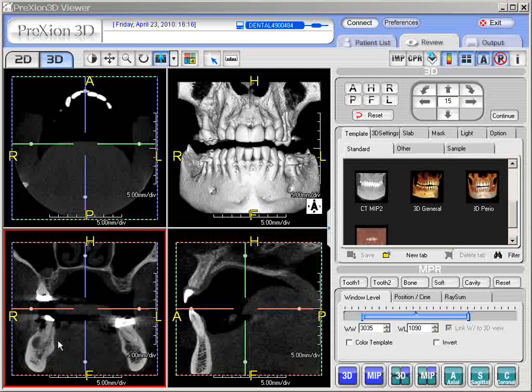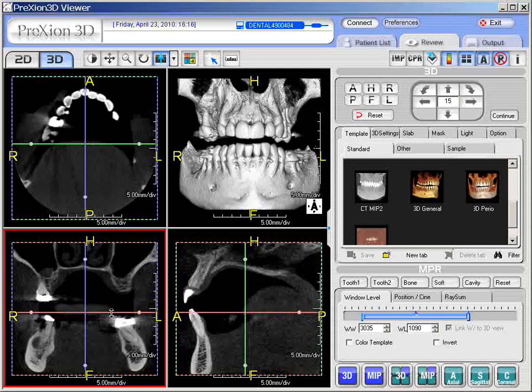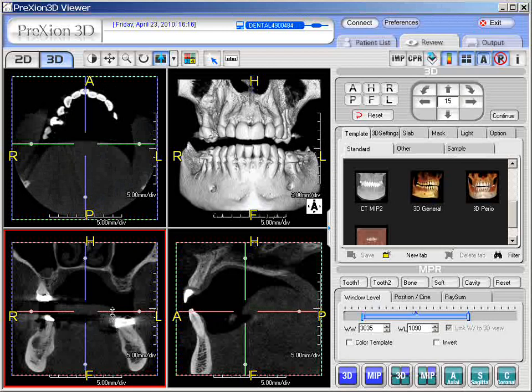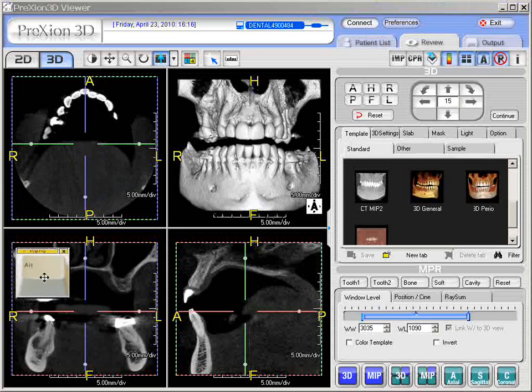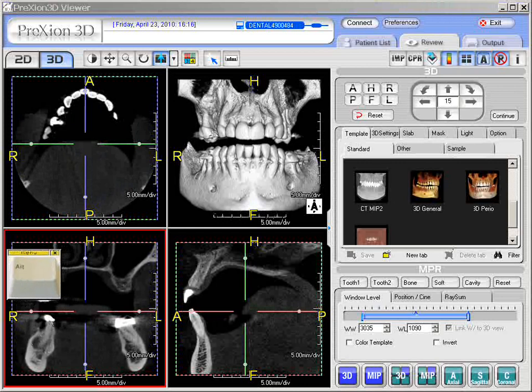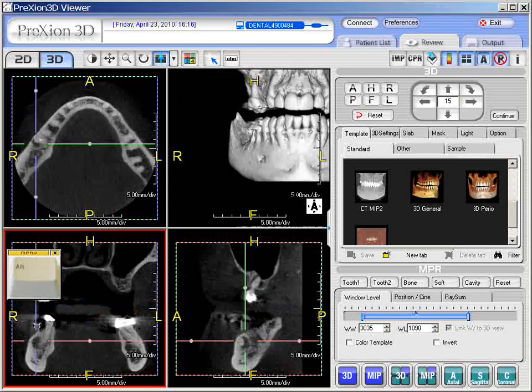To quickly evaluate an area in all three planes — axial, coronal, and sagittal — simply find an area of concern and click the ALT key on the keyboard. It's right next to the space bar. Once you click the ALT key, you'll notice a caliper appears. Left-click the caliper with the ALT key pressed down into the area of concern.